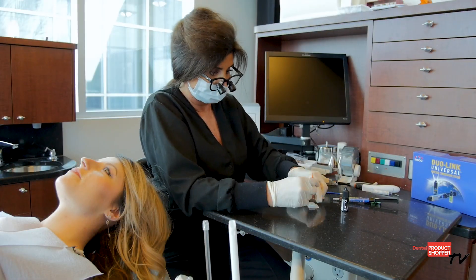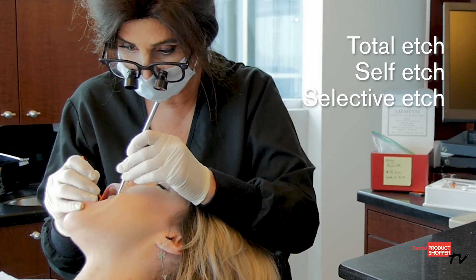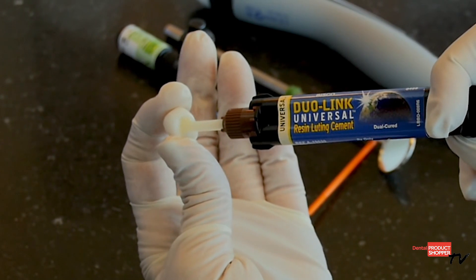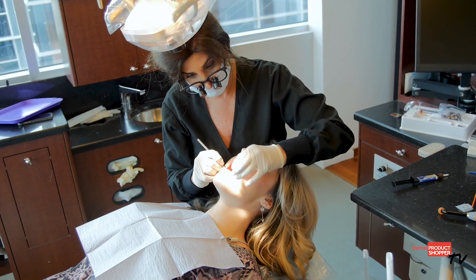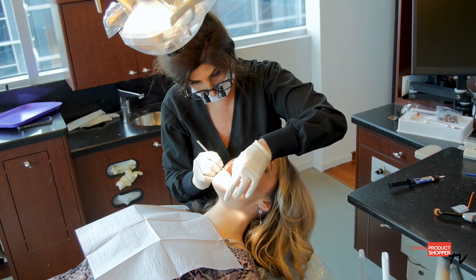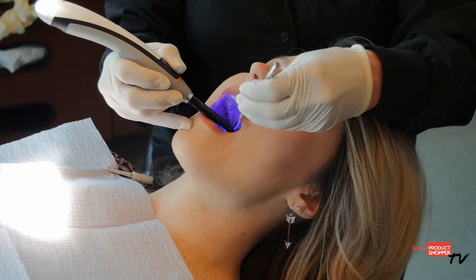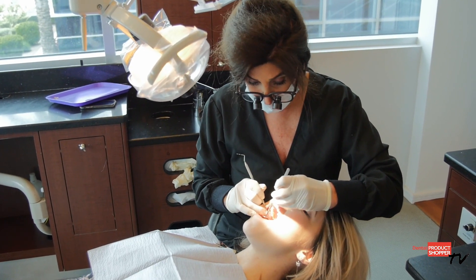Whether your bonding procedures require total etch, self etch, or selective etch, Duo-Link Universal is recommended for less retentive preps. When the taper is more than eight degrees and the prep height is shorter — around four millimeters — you start to think you need to bond the restoration in. Using Duo-Link Universal will guarantee quick and easy removal of excess cement.